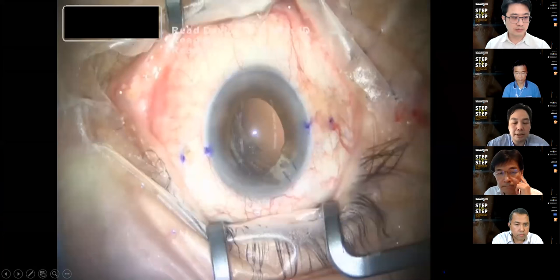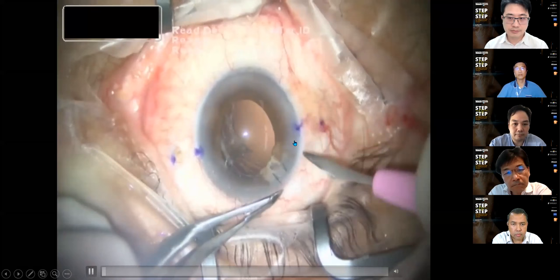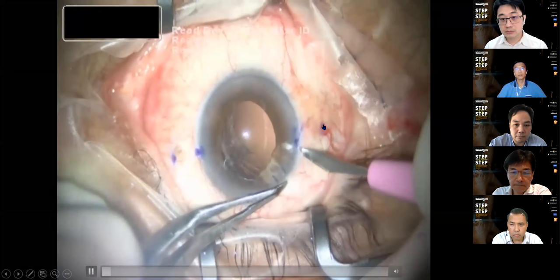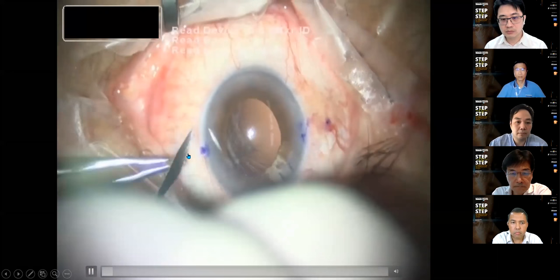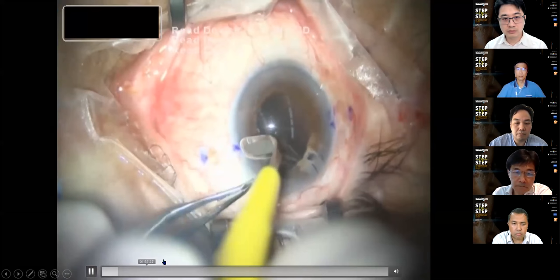This is a Hoffman pocket. One thing that I want to stress is that when you want to make a clear cut to create that pocket, please make it in the clear cornea. Don't make a nick on the corneal limbus, because that will hinder your view when you advance the crescent knife. Then you won't be able to see the tip of your crescent blade. And another thing is that watering the cornea itself may balloon up the corneal limbus. So that is creating the pocket.